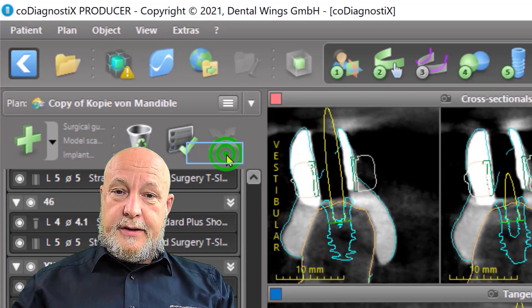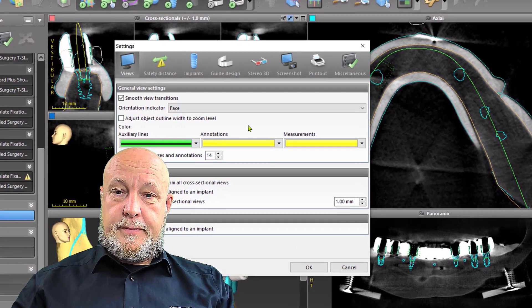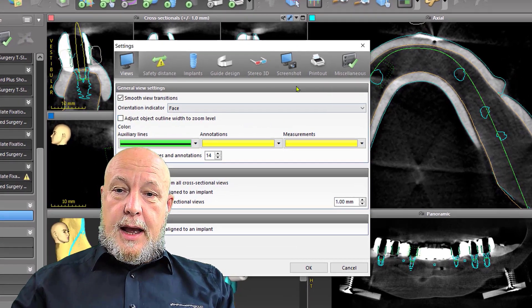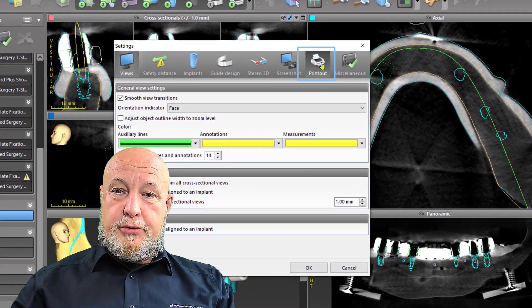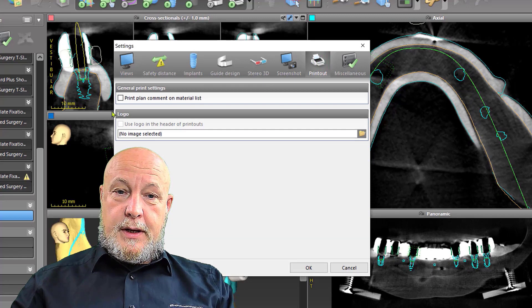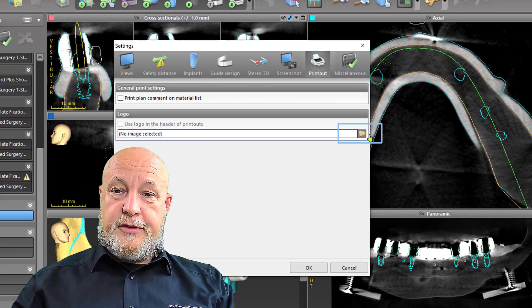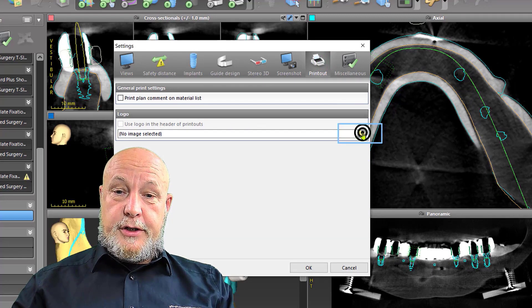Then we have the button 'Printout' and the possibility to insert a logo, so I search for it on my computer.